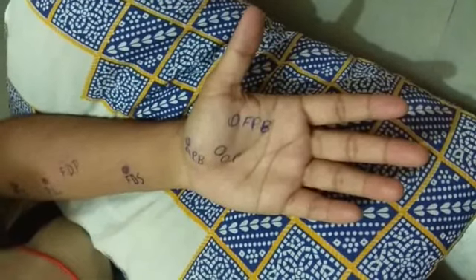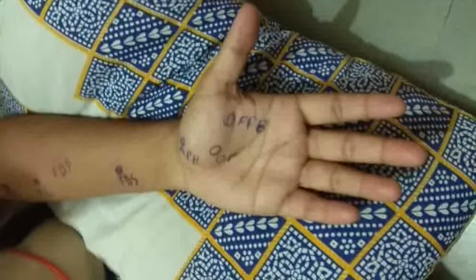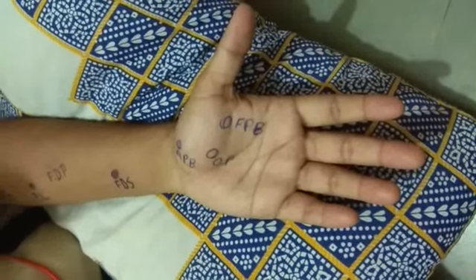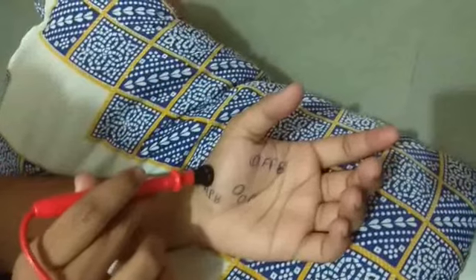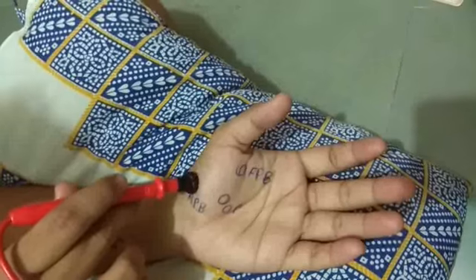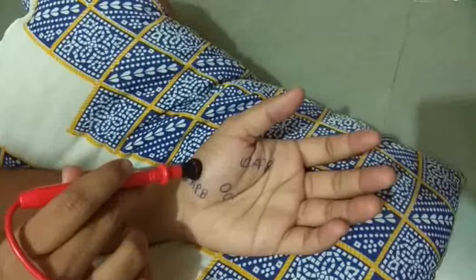The median nerve also supplies the thenar eminence of the hand. There are three muscles in the thenar eminence: abductor pollicis brevis, opponens pollicis, and flexor pollicis brevis. This is the motor point of the abductor pollicis brevis muscle. The action of abductor pollicis brevis is abduction of the thumb.